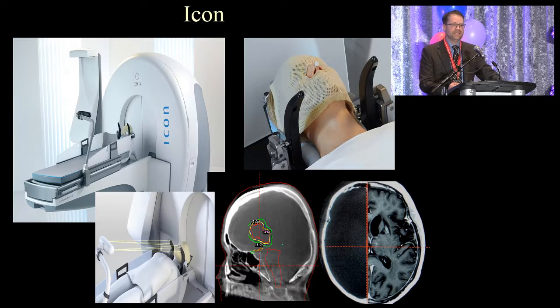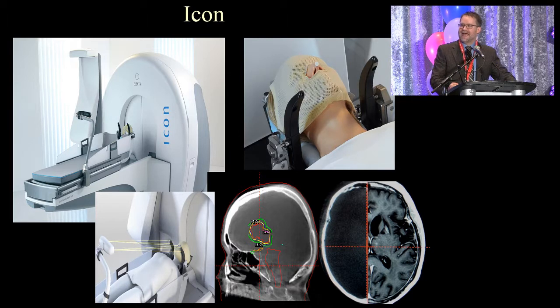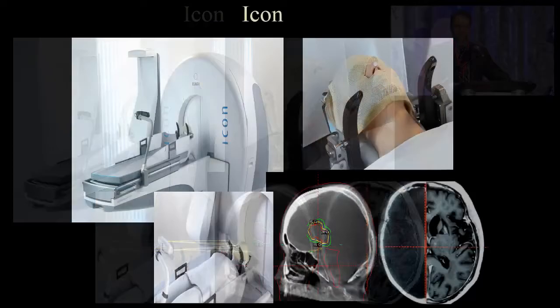But then came along this, the newest advance in intracranial radiosurgery. It's called the Gamma Knife Icon system, and it's a combination of imaging at the time of treatment with infrared sensors for evaluating patient position. We've done the work and looked at the verification of this. Using a mask, as opposed to having pins placed in people's skulls, we're able to achieve the same degree of precision. This has allowed us to be much more patient-centric with our care, increase our workflow, and become more robust with respect to treating multiple metastases, which were impossible before with the invasive frame.